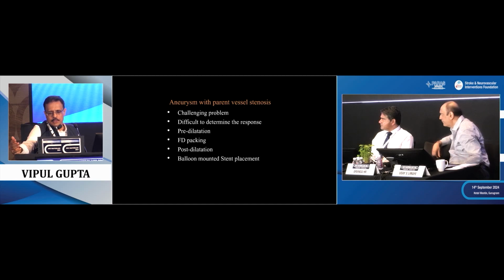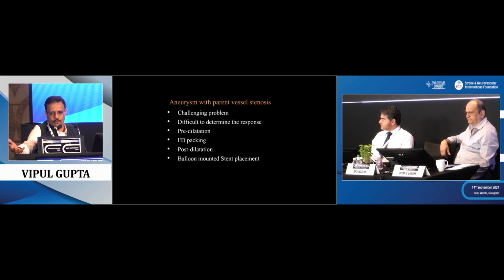So intracranial, as Uday raised, this is an MCA with a stenosis. What would we do? Would we not do the procedure, or are you okay with whatever we did here in the cavernous location? This is just the last question.